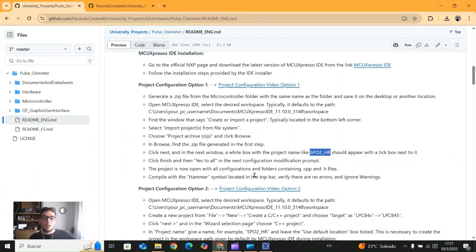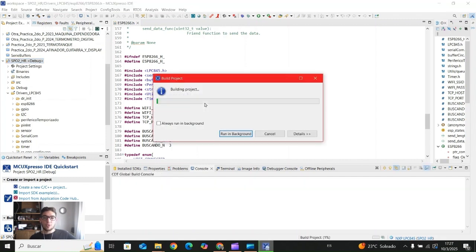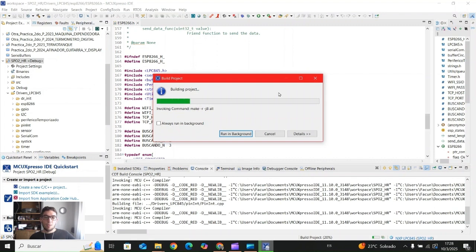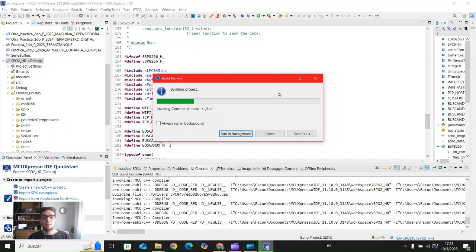Okay, now we have the project opened, like I said, with all the configurations and files. So we click on the hammer and we just compile it actually. We click on the folder name, like the project folder name. Then we click on the hammer symbol, and hopefully we're going to have all the settings and everything right, and everything is going to be compiled with no problem. We wait a few seconds. It is like building the project.